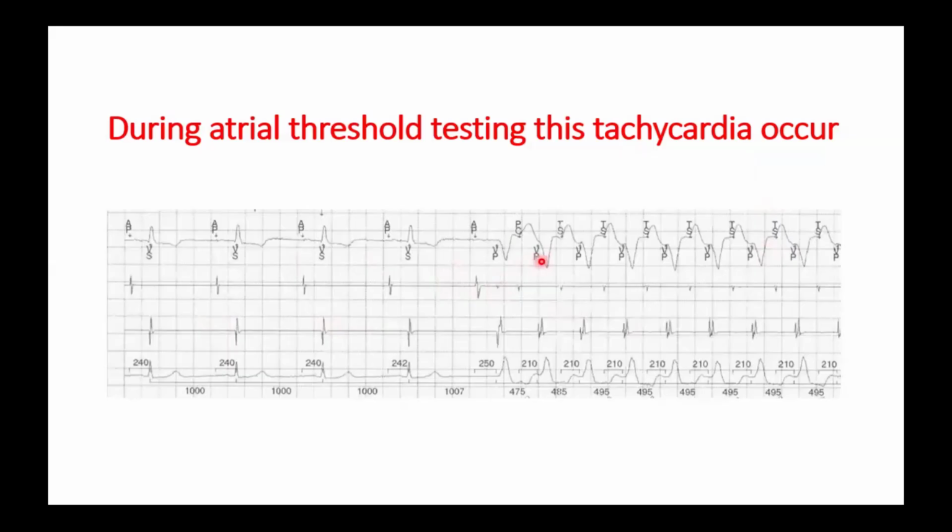We need a volunteer. What is this tachycardia? Amr Gamal, open your microphone and answer. Say anything. We are accepting anything. Please. From Bitar, Muhammad Bitar, please. Open your microphone, Bitar.